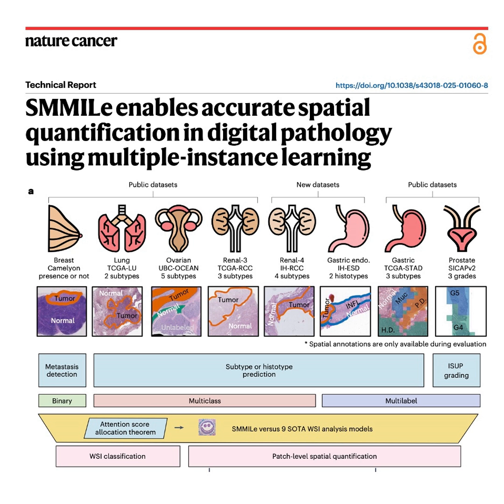They still can't set that unified decision boundary across the subtle margins of a tumor. SMMILe's MRF peer pressure module captures the subtle margins that the others, despite their great lenses, completely miss. So the framework itself matters just as much, if not more, than the foundation model. Exactly. There was one tiny exception in the data, though, regarding the breast and ovarian datasets.